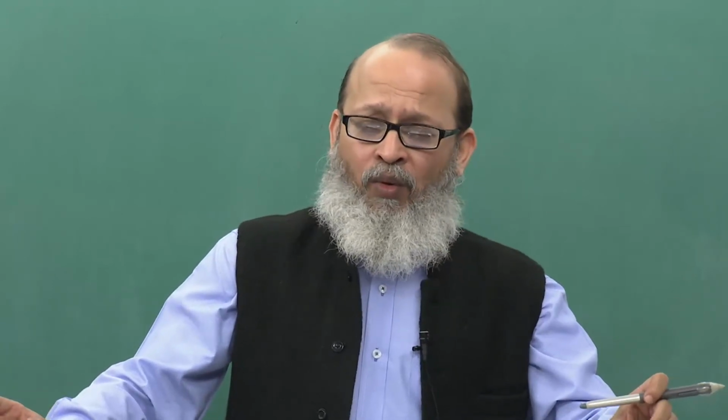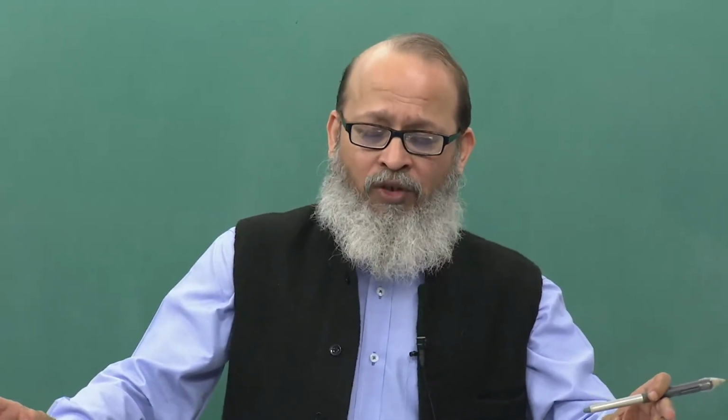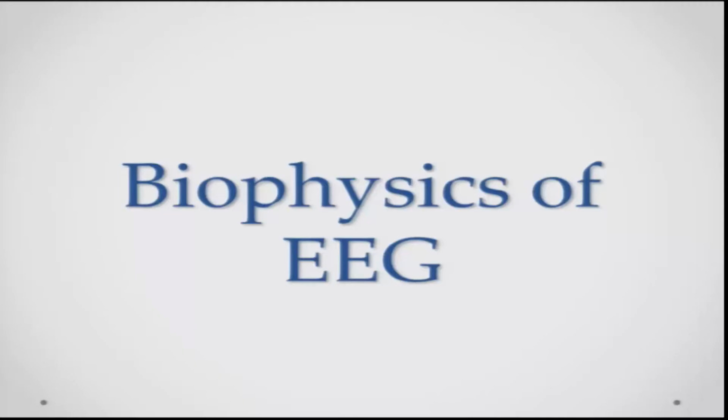So, we talked about spatial imaging, and I would like to introduce you briefly to what we do when we want to look at the question of when it is happening in the brain. That is temporal imaging, and the most common and popular tool is EEG. As we know by now, there is electrochemical activity in the brain. If there is electrochemical activity, there has to be an electric field, by basic understanding of physics.